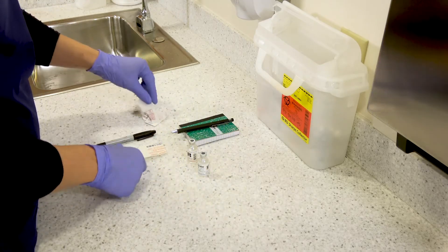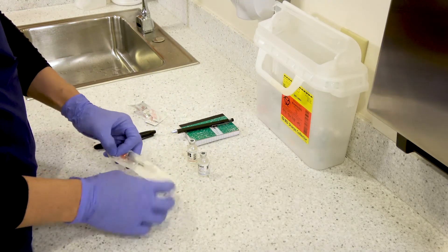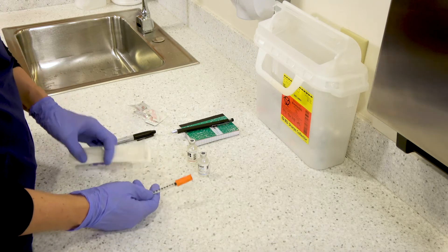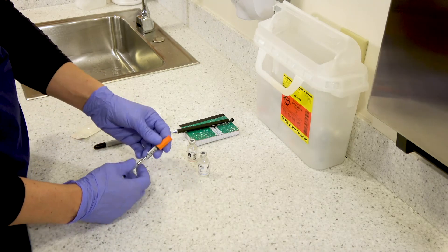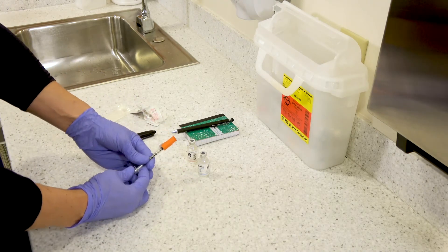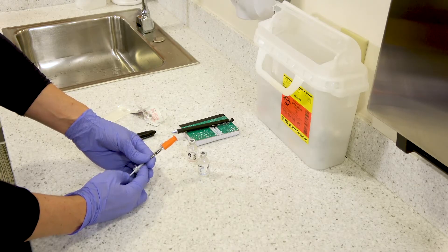Once you have your vials clean you want to grab your insulin syringe and then you're going to draw back the total amount of air that you need. So in this case that's going to be 15 units.